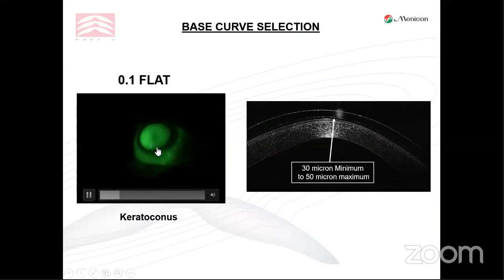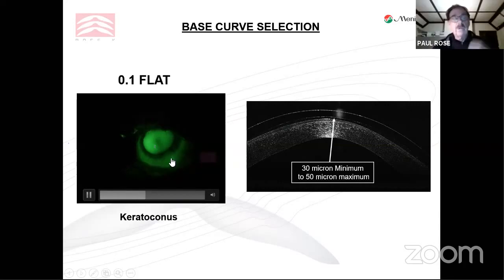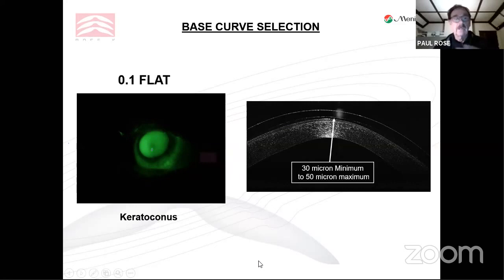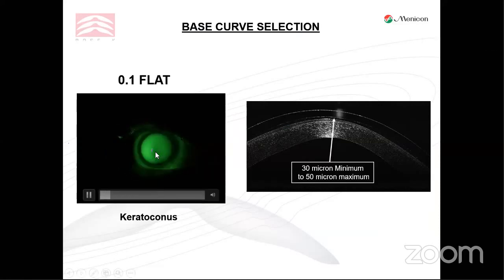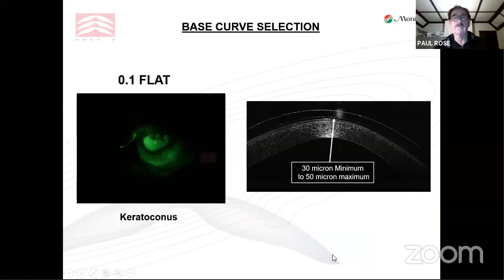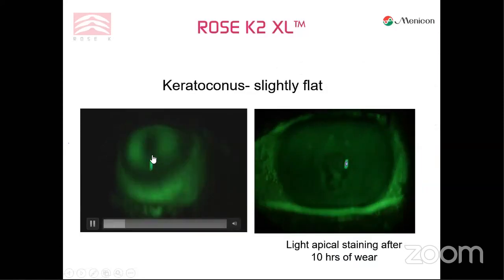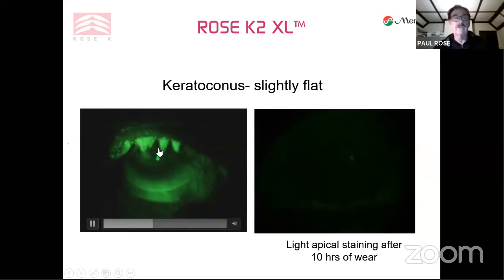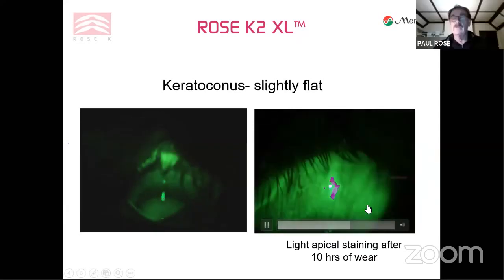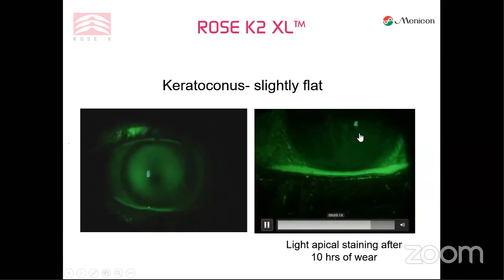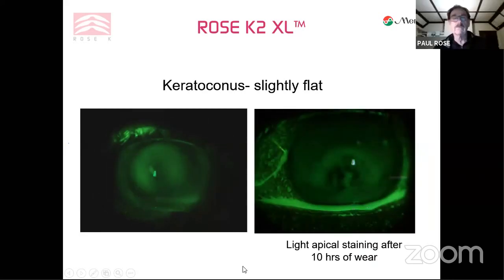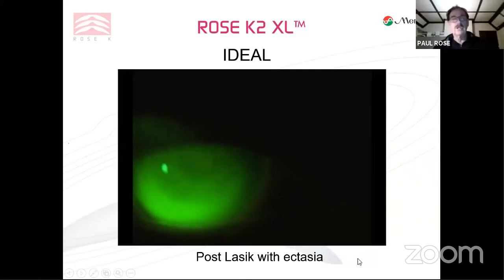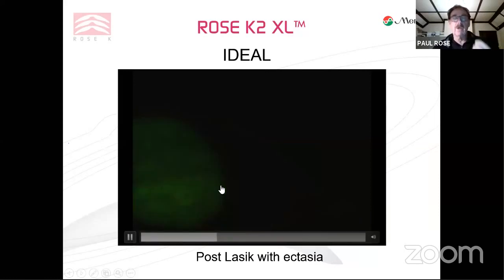Here is a keratoconic fit — I used to say that was okay, but I now say that's a little flat. When the patient blinks and the cone disappears, it's acceptable. But if the patient blinks and you still see touch, it is flat. I want to see around 50 microns — absolute minimum of 30 microns of clearance. Here's a keratoconic I thought I'd fitted well when I first started using my design; I left it a little flat and after 10 hours of wear, you can see staining at the apex of the cone — unacceptable. Here is a post-LASIK ectasia that is acceptable: as the patient blinks, we just see touch and then it goes. I'd be very happy with that fit.